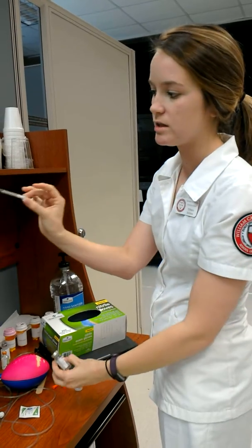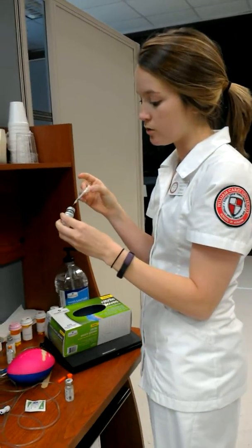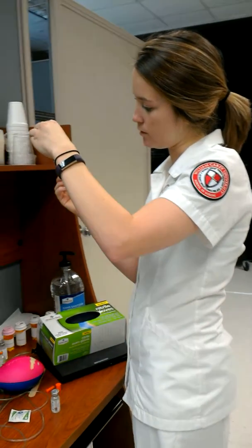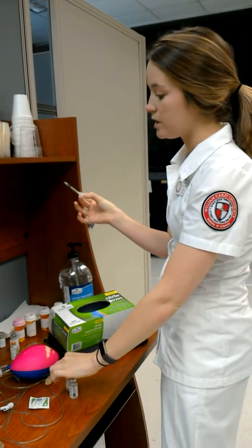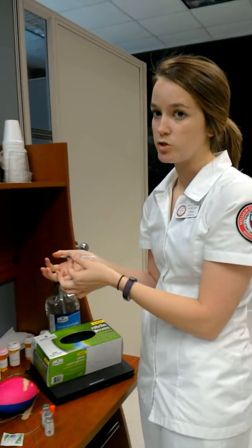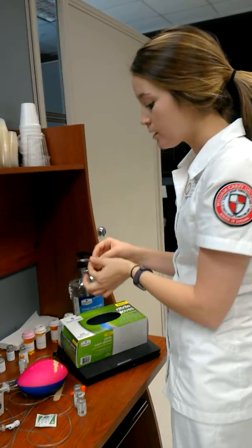Okay, as you can see, I have 5 units, and then I'm going to come to my intermediate and draw up 5 more units, and I should get a total of 10. And so I would take this and I would get a second nurse to double check because this is a high alert medication.